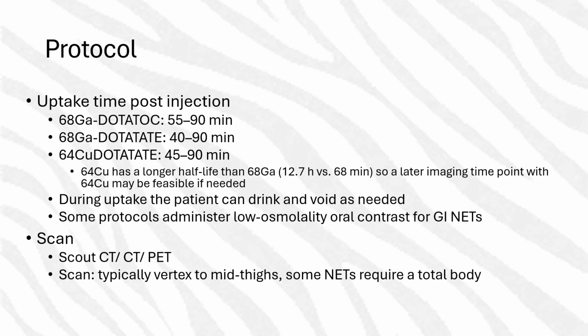There is also a slightly different uptake time based on the radiopharmaceutical being used. For gallium-68 DOTATOC, it's 55 to 90 minutes. For gallium-68 DOTATATE, it's 40 to 90. And for copper DOTATATE, it's 45 to 90. Now, that is only varying slightly, and a lot of that has to do with the different drug companies doing their own clinical research, and that's what they came up with and recommended. But it's all very similar. In the real world, most people will wait about an hour before they start scanning.